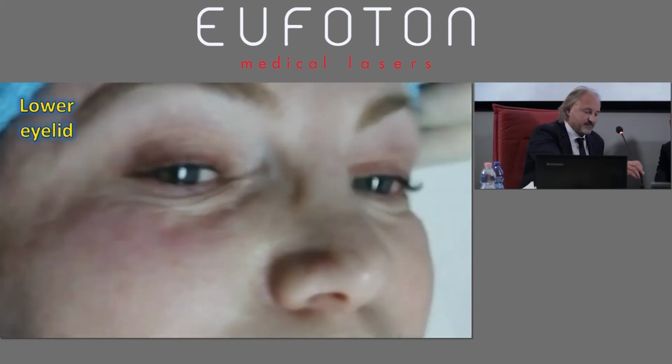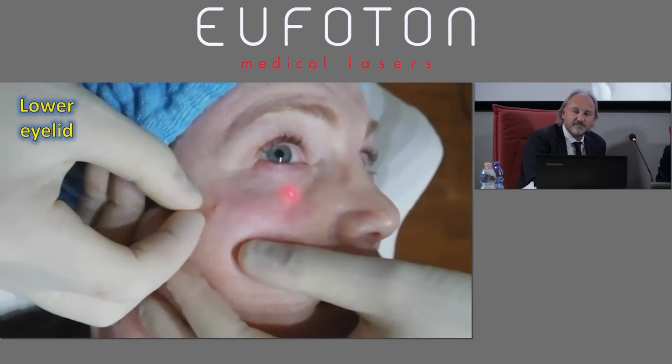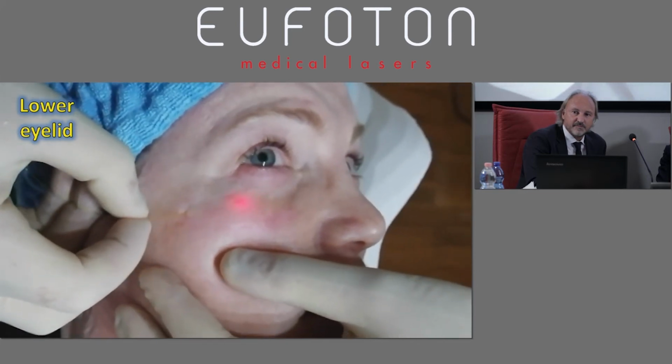Third question is about the tip of the fiber. We have, I think almost all of us, also ceramic tips.